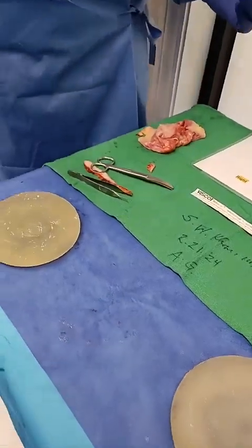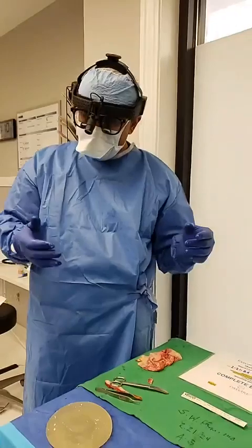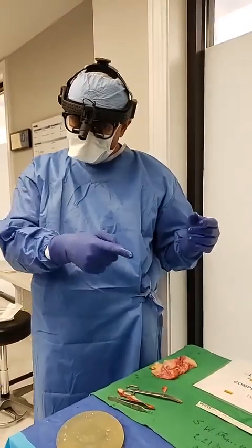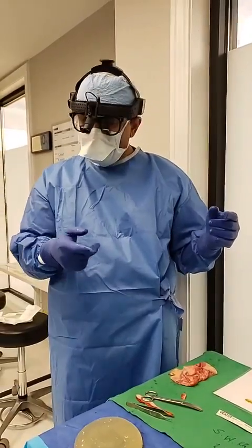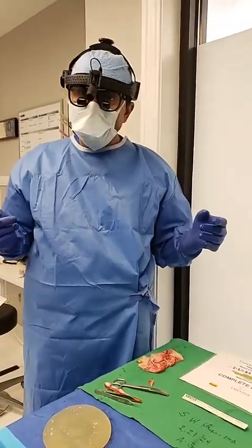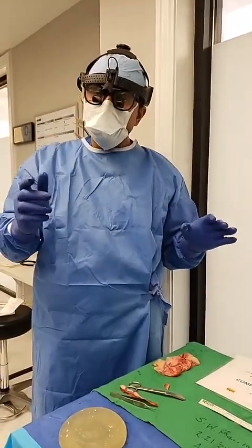So, complete removal of the entire implant capsule, all inflamed tissue, all contained. Good for her. Both of these are intact, textured. 300 on this side, and I'm going to assume 300, and she said 300 when she got it back in 1991. Nice lady, 67 years of age. So she got the surgery.